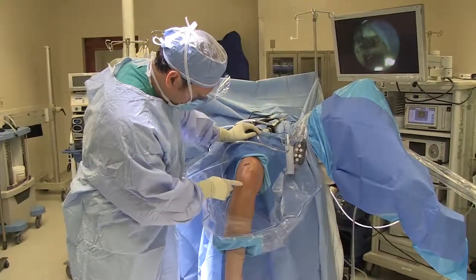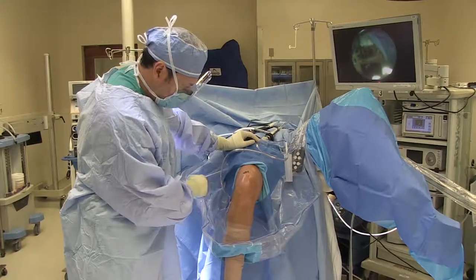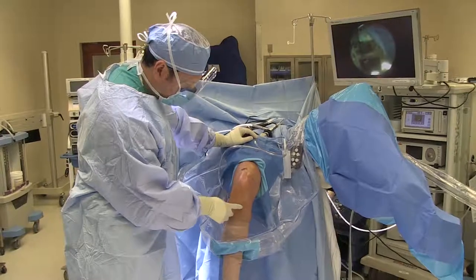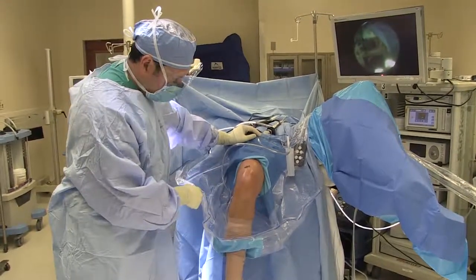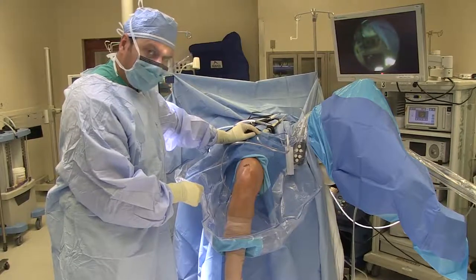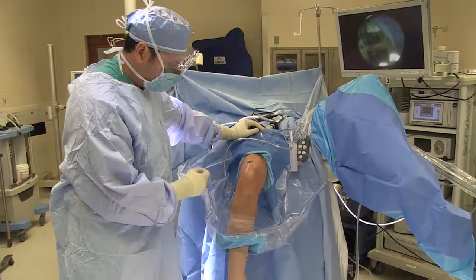She had a previous ACL. You can see her bone-patella tendon-bone incision. Her femoral tunnel is quite vertical, and she went on to fail that. Three or four months ago, I revised that and performed a hamstring ACL. You can see my hamstring incision and my scope portals. We now have her with a stable knee, but she had a medial femoral condyle lesion which we treated with a chondroplasty at her last surgery. She's continued to be symptomatic.